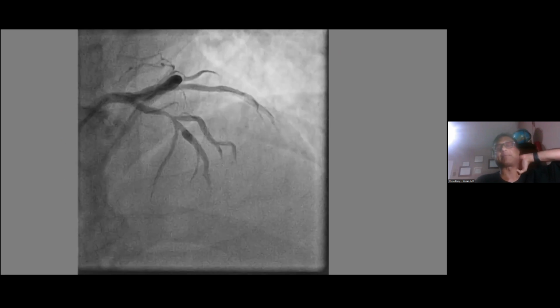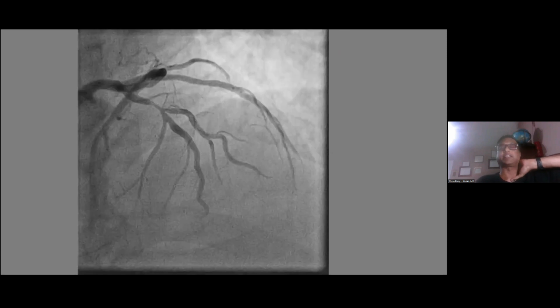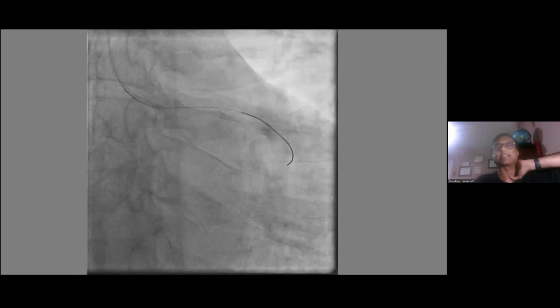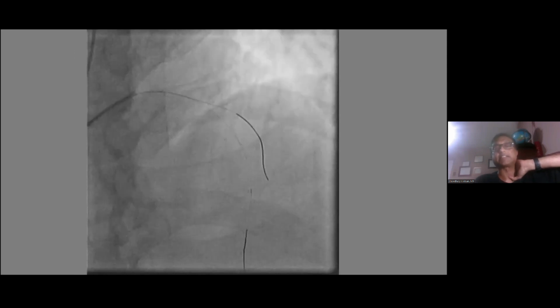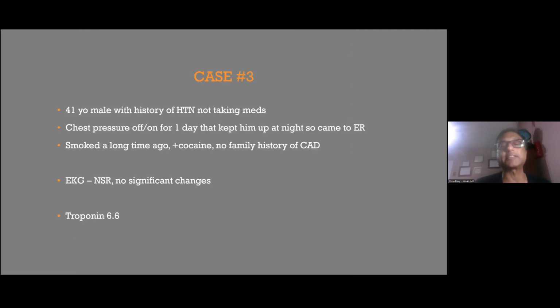And then this is another bifurcating lesion. We talk about bifurcation and strategy. Should we do one stent or two stents? How do we assess this? These are important issues. And if we can save a stent and then see the focal stenosis following this, we have a backup plan for bailout. But if the IFR is good on the diagonal, probably we don't need another stent.